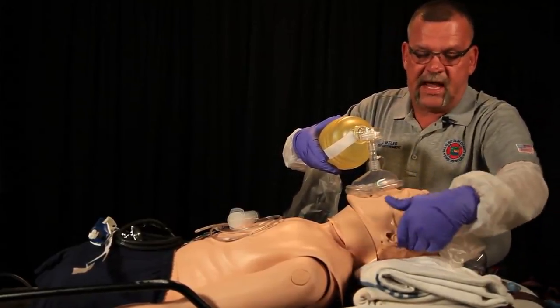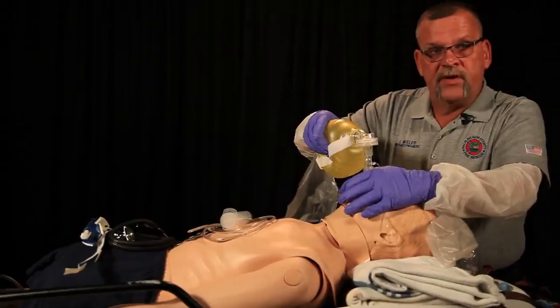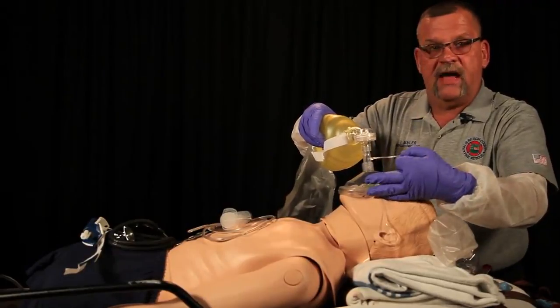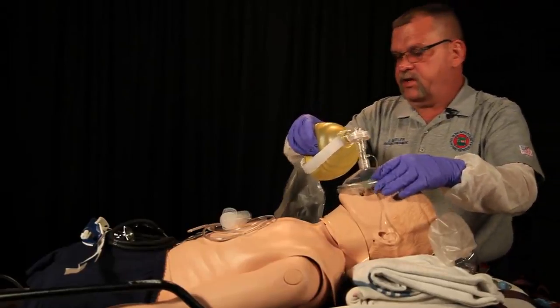So you can see that we have towels underneath the head and we have the airway in an appropriate position. We want to deliver two breaths to make sure that the airway is patent. And notice that we do have our capnography attached to the ambu bag during our resuscitation attempts.